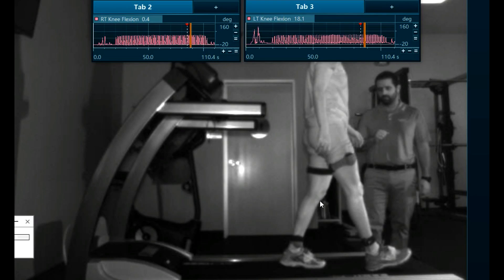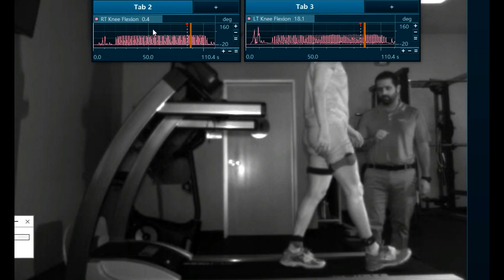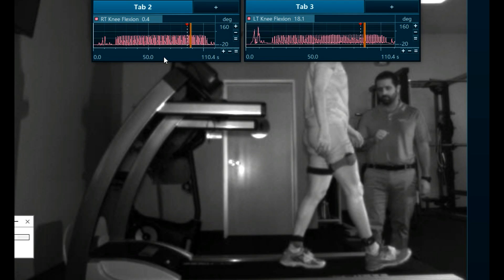This is how we capture our data at Competitive Edge at our gait lab. What you see here is an initial contact angle at the knee of 0.4 degrees, which is excellent. We should see an angulation between 0 and 5 degrees for that initial contact angle.